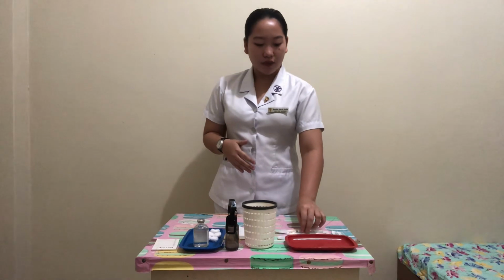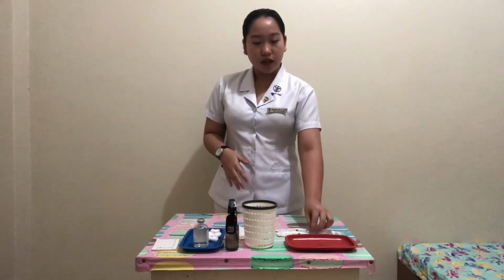So to prepare the medications, we need to have syringes. I have a tuberculin syringe for intradermal injection, an insulin syringe for the subcutaneous injection, and a 25 gauge syringe for intramuscular injection. And I also have here aspirating needles, which are used to draw medication from a vial and ampule.